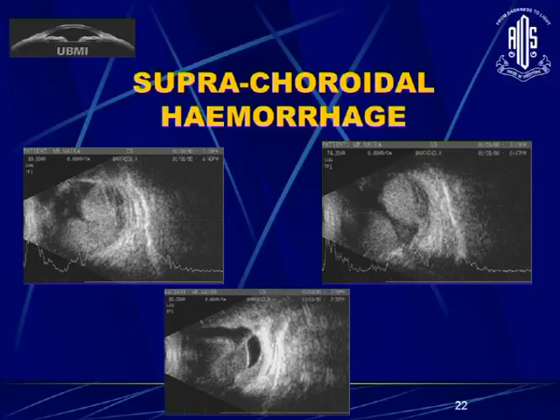He said, okay, let's get an ultrasound done. So he came to me for a follow-up ultrasound. Now you see here, this mass lesion which was seen completely here, you start seeing two bumps here, and the optic disc area is now becoming very clear. So this was suprachoroidal hemorrhage, which has started resolving here.